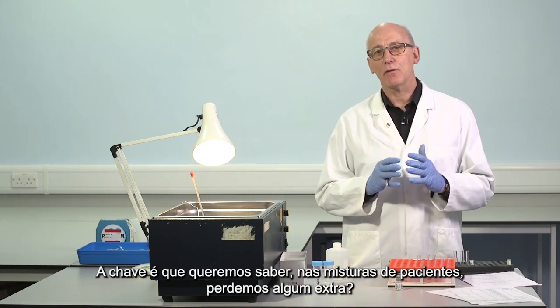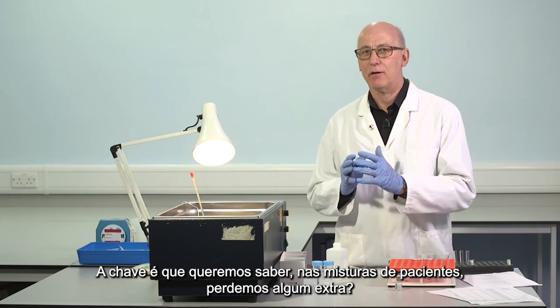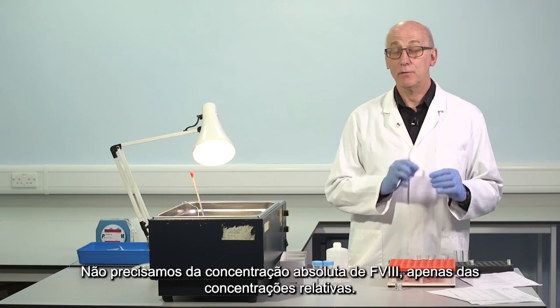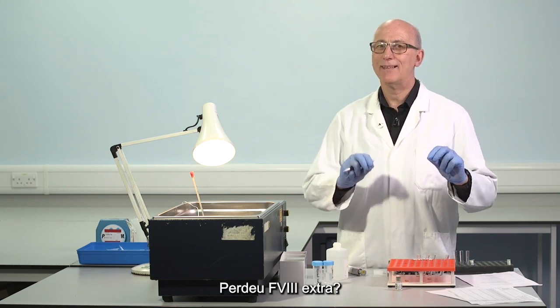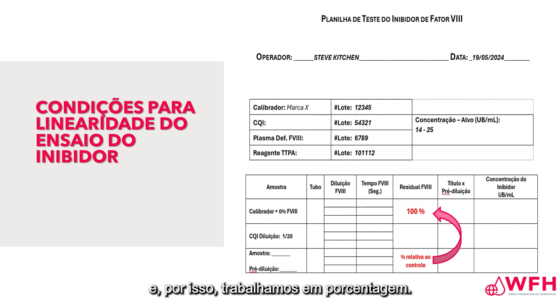The key is that we want to know in the patient mixtures, have we lost any extra? How much do they contain relative to the control? We don't need the absolute factor VIII concentration, only the relative concentrations. Has it lost extra factor VIII? Therefore, we work in percentage. What is the percentage in the patient mix? Percentage relative to the control.